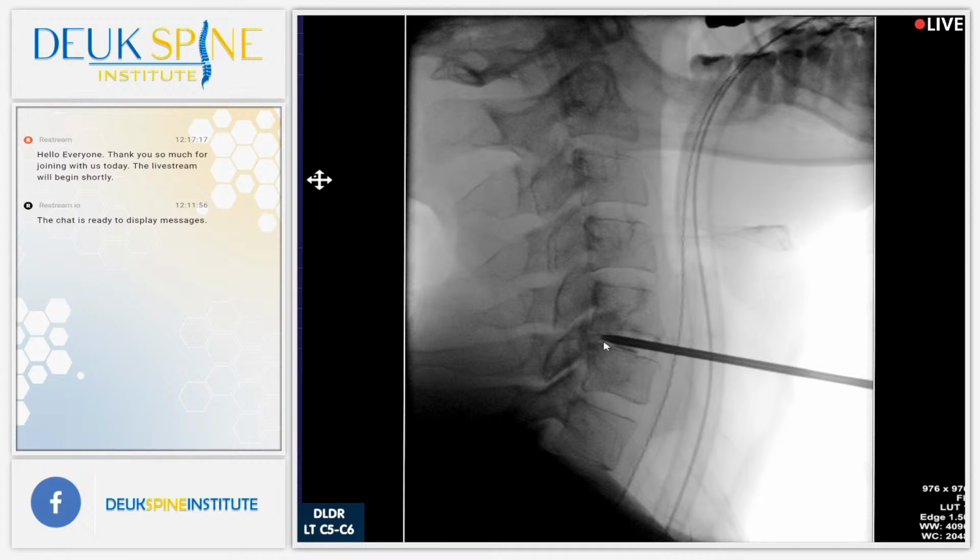I'm just going to use this whole sequence for our new website. So arrow at the tear. Show me the tear. There it is. See how the dilator tip is right at the tear? Show the herniation. Yes. Okay. Henry, do you get a few more screenshots there? Yes, I did. All right.